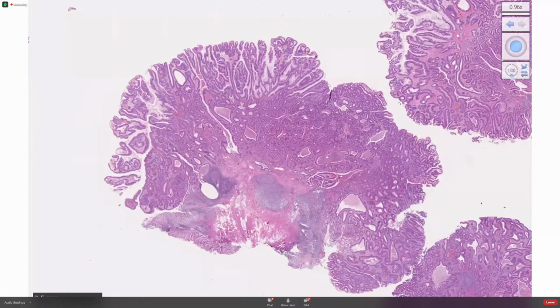Here is a question from the audience. Will snare tip coagulation of the margin help in this case? Unfortunately, we tried to perform en bloc resection. However, I was afraid of perforation, so the resection depth was slightly shallow. A small amount of the region remained, so we performed a slightly piecemeal resection. But most of the region was resected en bloc.